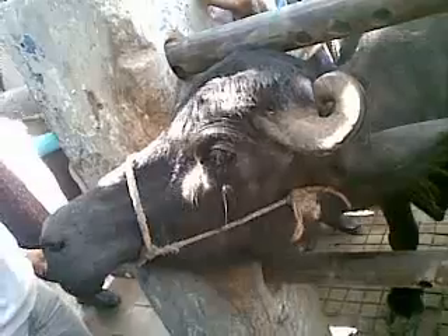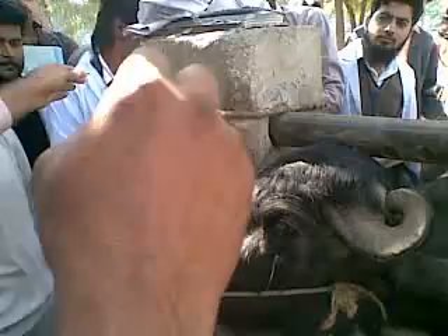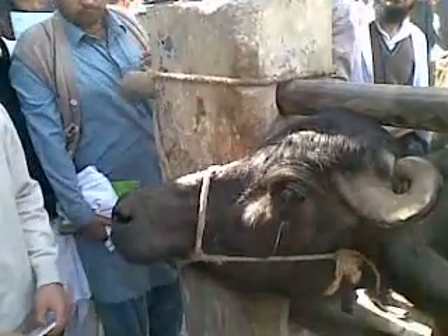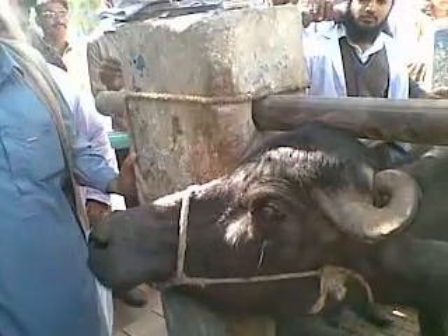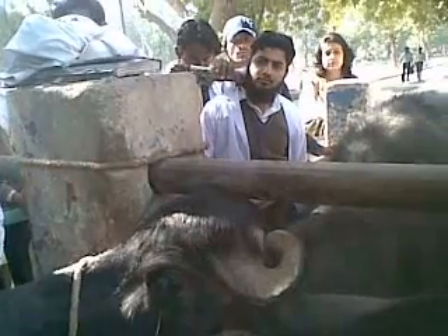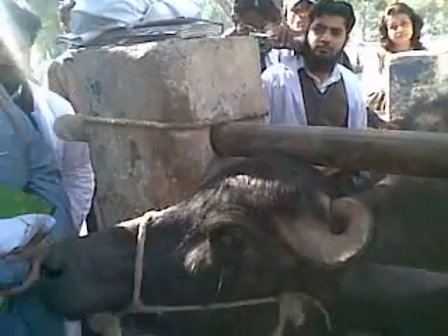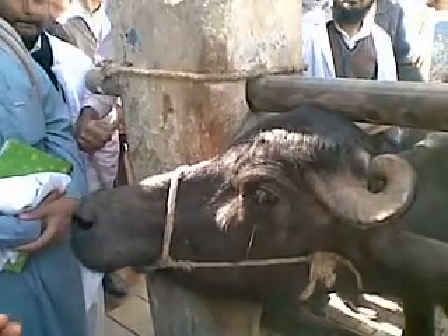De-horning is being performed in buffalos to make these animals less dangerous for human beings. In Kundis particularly, the horns are very circular and therefore they always damage the soft tissue of the head, producing wounds and making the animal very uncomfortable.